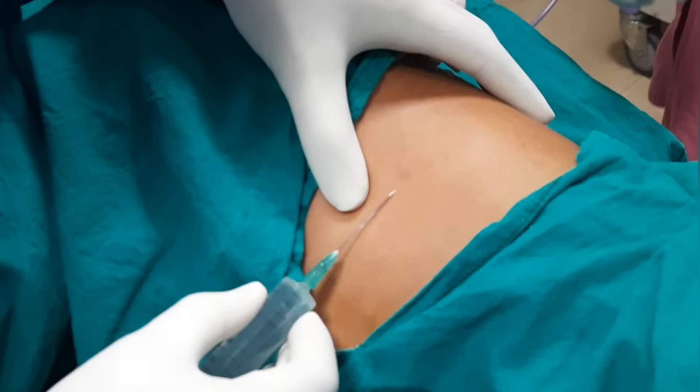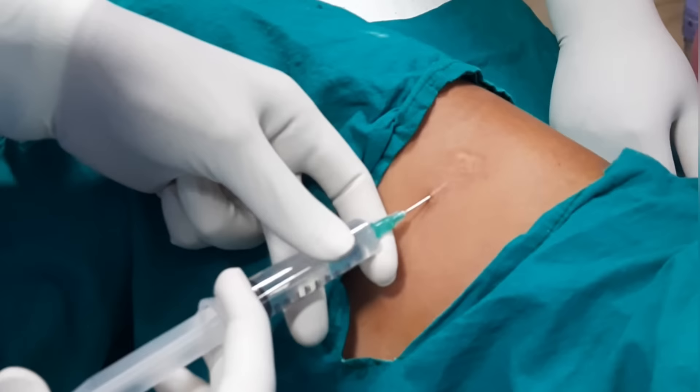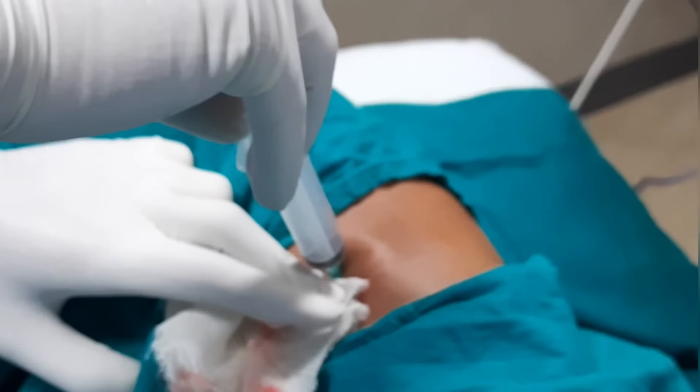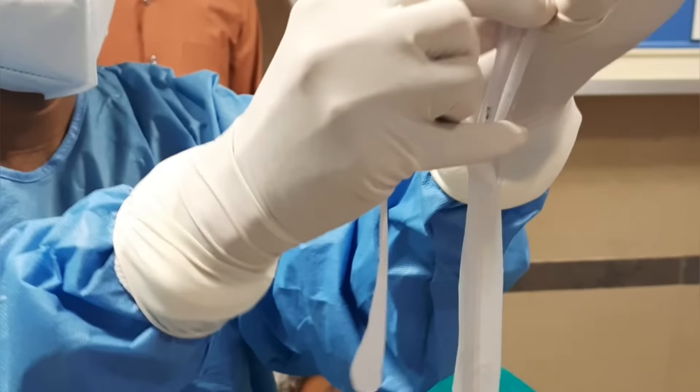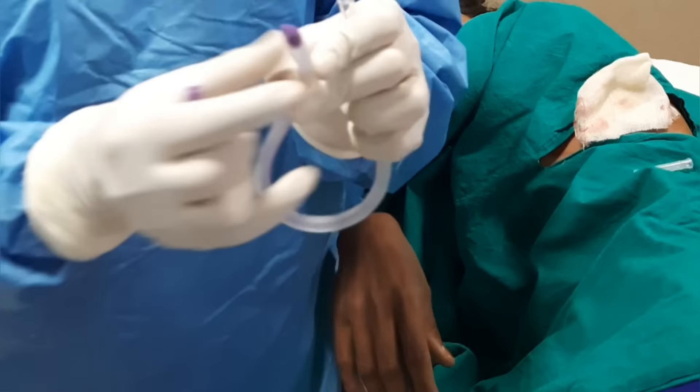We will clean the site with betadine for sterilization. Before inserting the needle, we confirm our insertion site by ultrasound again. We give local anesthesia using 1% lignocaine mixed with adrenaline — first infiltrating the skin, which is a very pain-sensitive area, then going millimeter by millimeter down, anesthetizing the pleura and ribs, as this is a very painful area. After inserting into the pleura, we aspirate and confirm — in this case it is air, confirming pyopneumothorax. Without confirming pus or air, we should not place a chest tube.